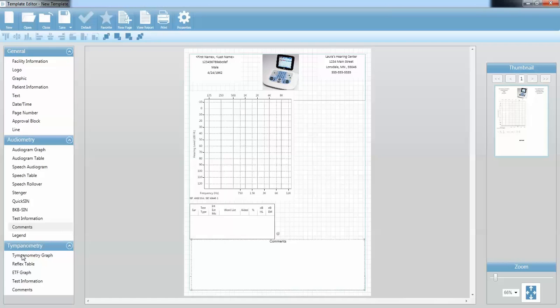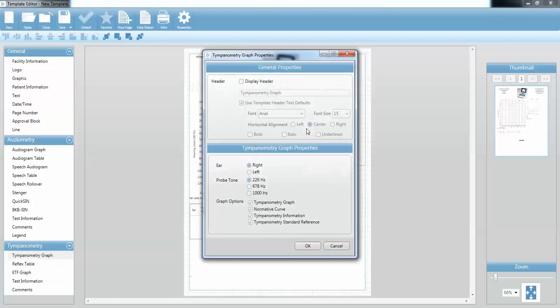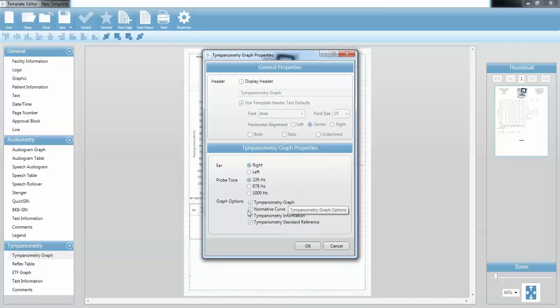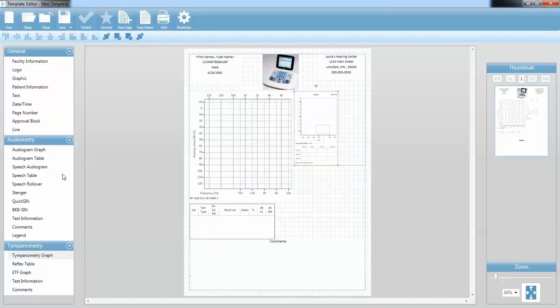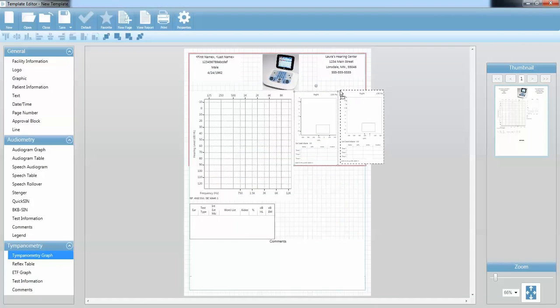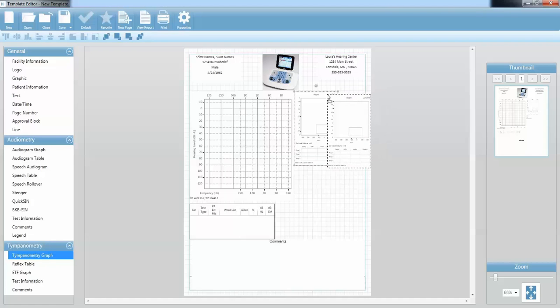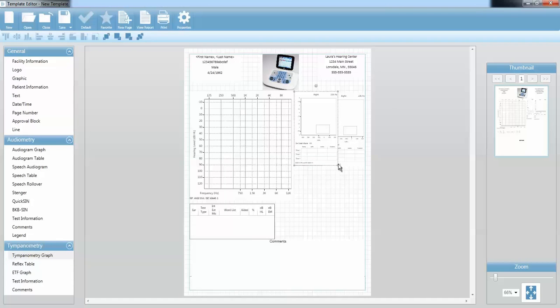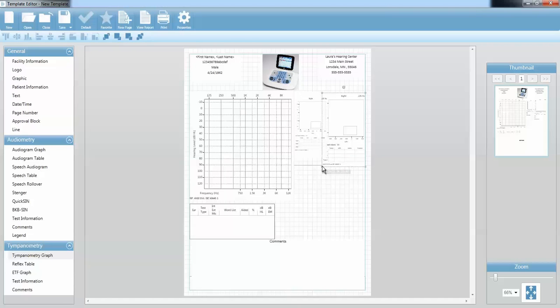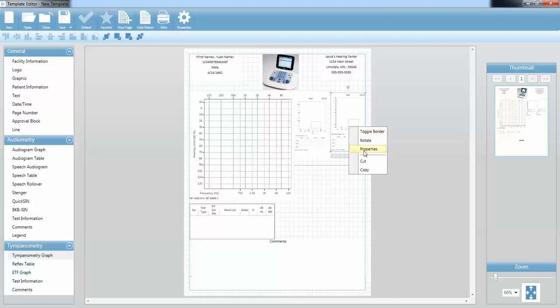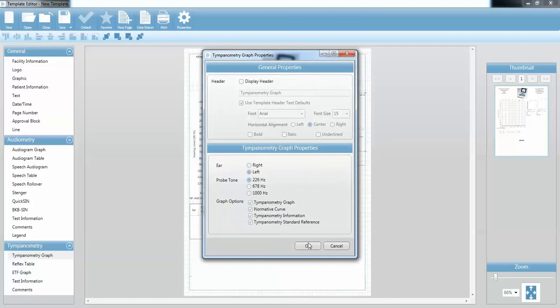Now I would like to put a tympanometry graph on there, so I'm going to drag that over and place it right next to my audiogram. I'll double-click and check the properties — this is the right ear, 226 hertz. I want the tympanometry and the normative curve, and all the rest of the settings will be fine. I need another one for the left ear, so I'm going to drag that over. It doesn't quite fit on the page, so I'm going to resize those a little bit. I'm going to make this one a left ear by right-clicking and going to Left.